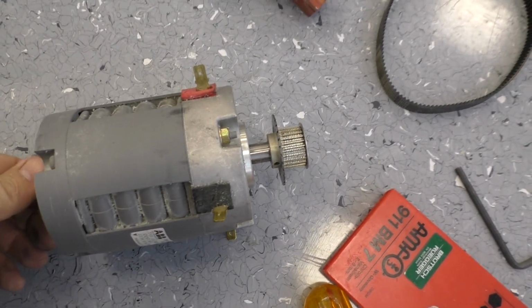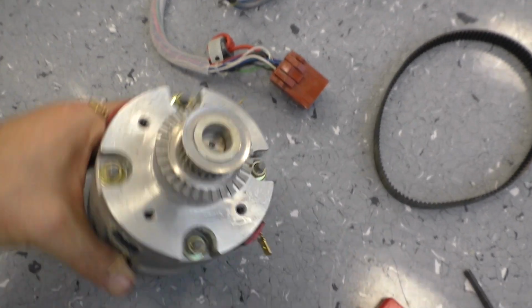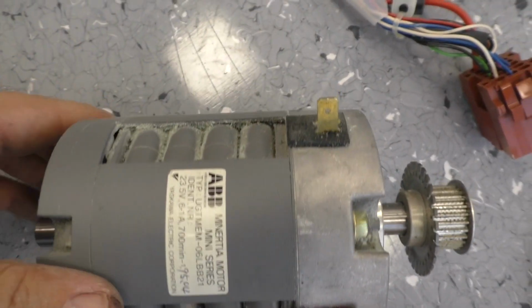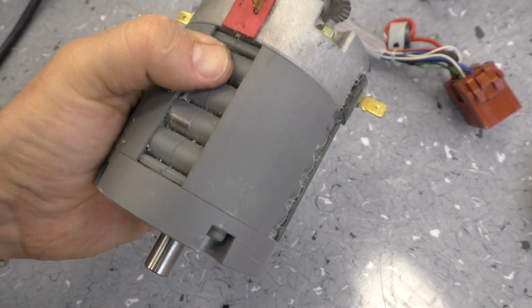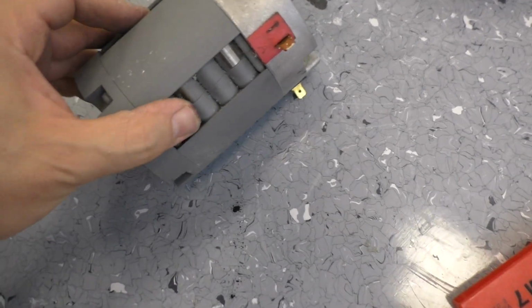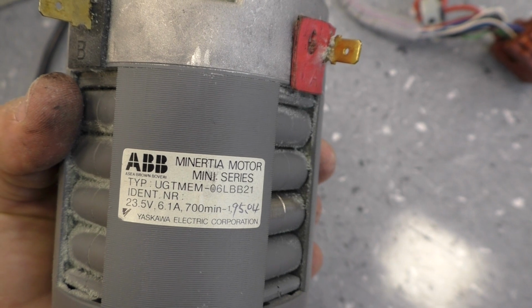A nice motor. It's a 4-brush DC motor, 2 positive, 2 negative brushes, and it's covered with the same green dust as you always have in medical equipment. Funny arrangement of the magnets here. Are they magnets? Maybe. Or a little bit loosey-goosey here. Don't know what the trick is about this. Maybe we find a data sheet somewhere. Maybe not.